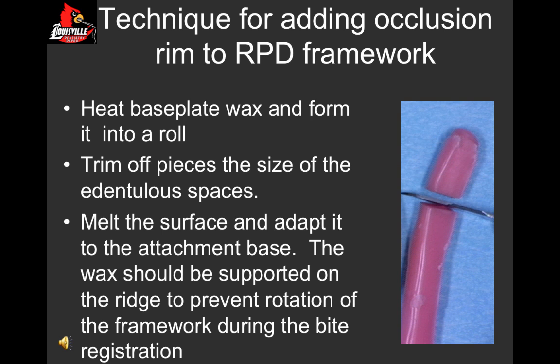The wax should then be supported on the ridge and help prevent rotation of the framework during the bite registration. You don't want that framework to actually be able to seat during that exercise.